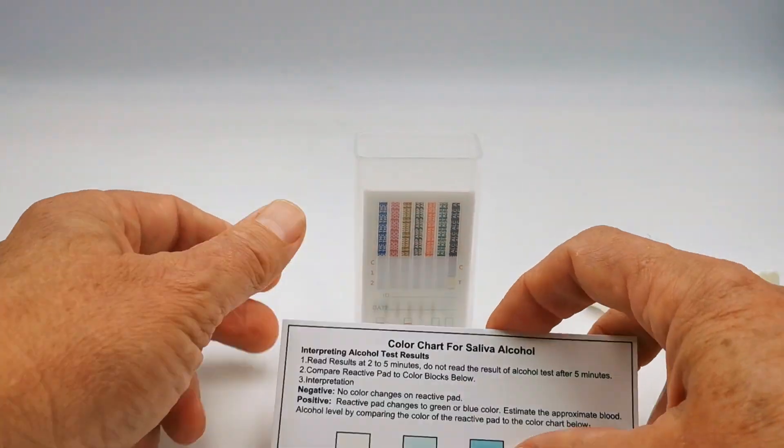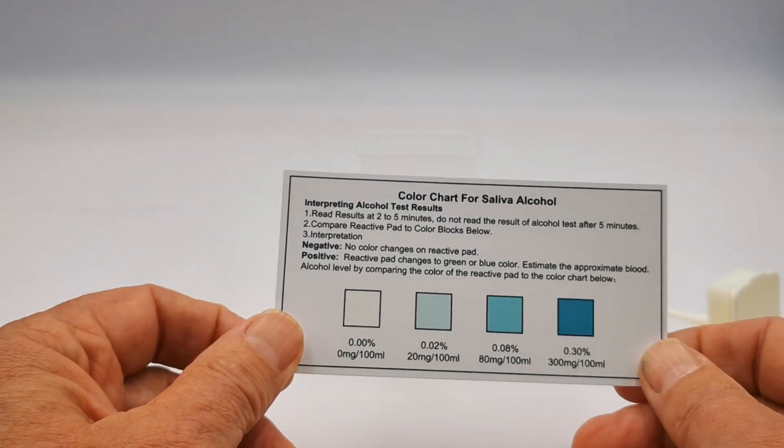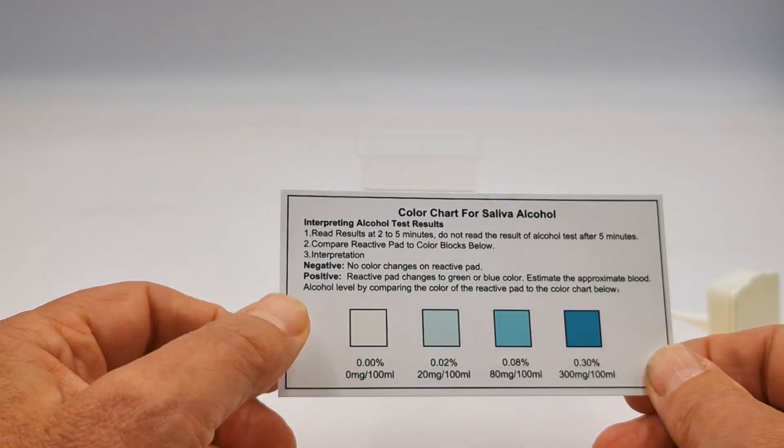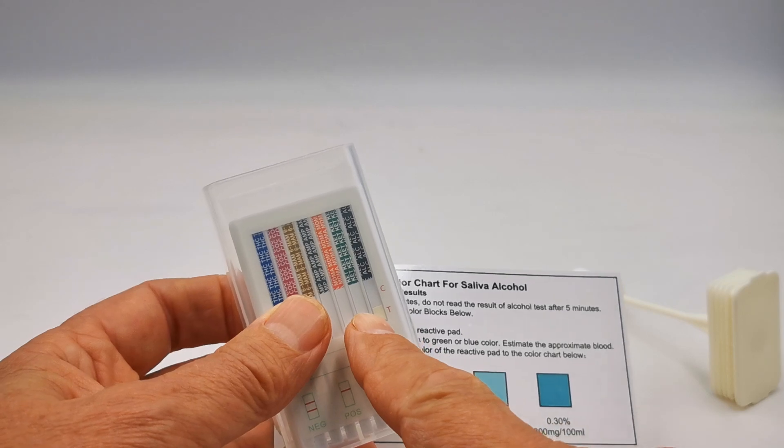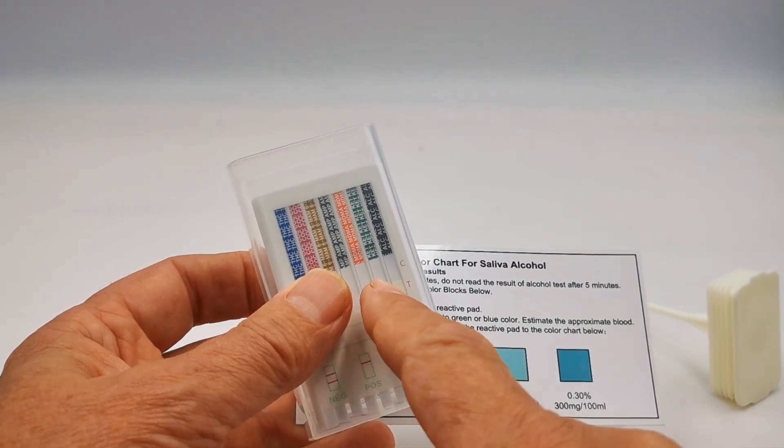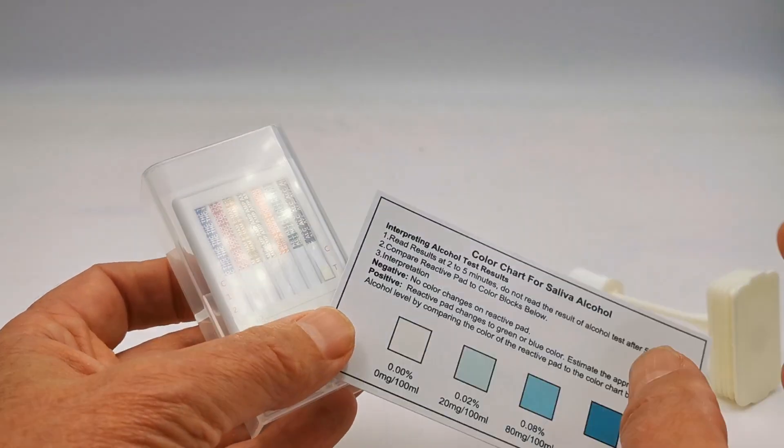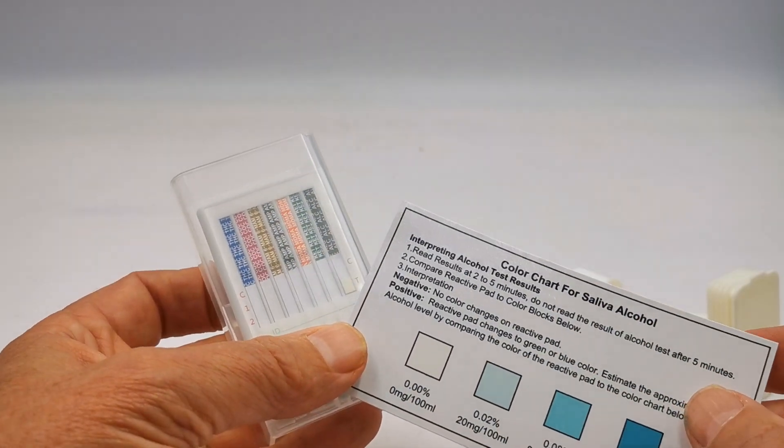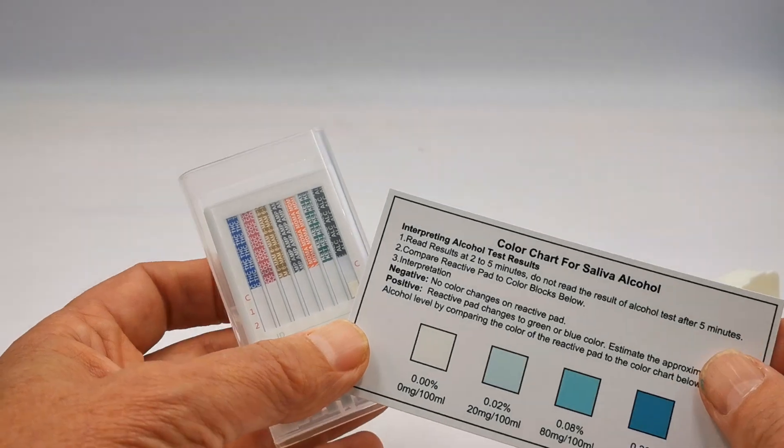Also supplied with your test will be a color chart for the saliva alcohol interpretation. This is on this pad here on the right hand aspect of the columns as you look at the front of the test, a little white pad, and you'll see that corresponds with the negative coloration on the saliva interpretation charts.